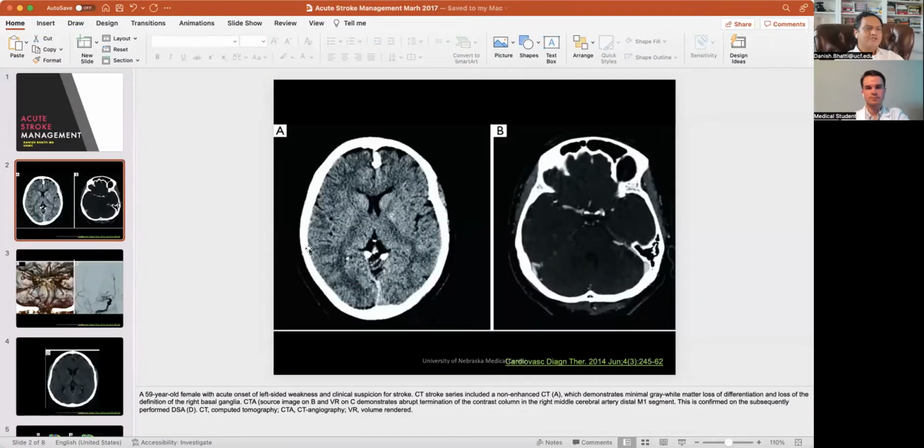These are mostly pathologies related to stroke. So this is a CT scan of a patient with stroke. As you can see, the stroke has just set in, so it's almost impossible or nearly impossible to say if and where the stroke is. The only difference you might notice, if you pay close attention, will be that there is some loss of gray and white matter distinction in this area, where it's all becoming blurred.